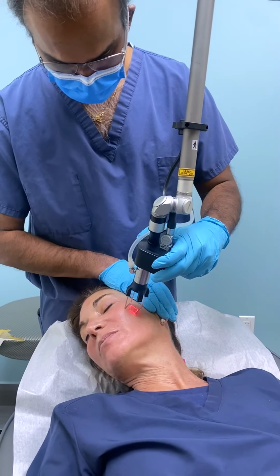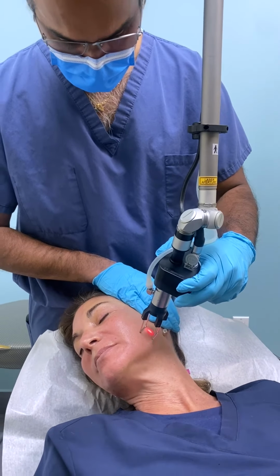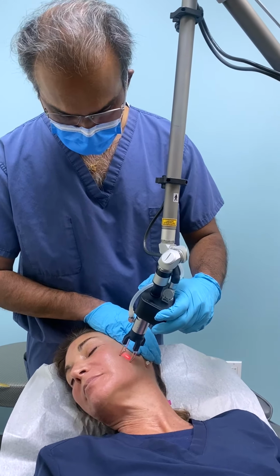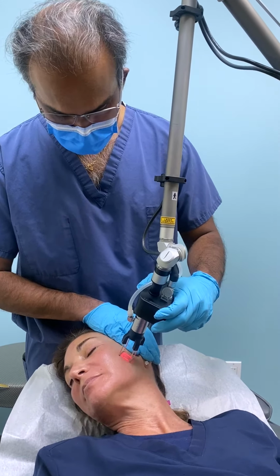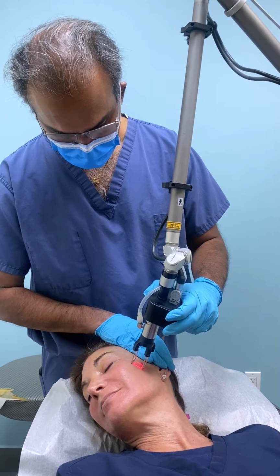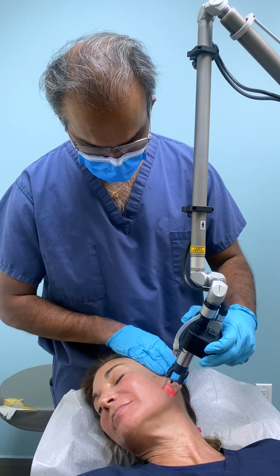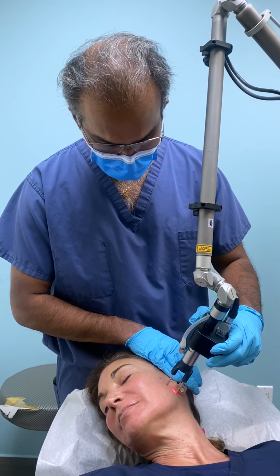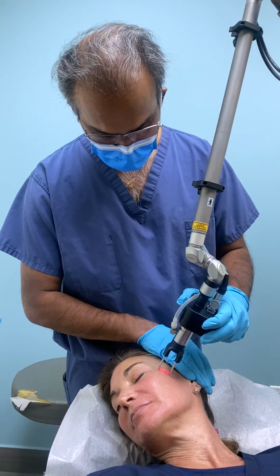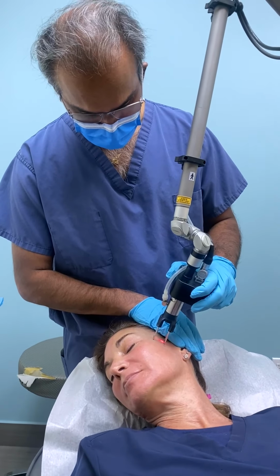And with the laser, then, what do I expect to see? Like the tightened skin, right? The fine lines. So, this specific laser, I think it's good for patients to really understand. This particular laser, which is a CO2 laser, is what I'm using, carbon dioxide laser. You can think of it as a pressure washer on the driveways, because it essentially peels off the surface dirt on the driveway, right? With the force. The laser does something somewhat similar. So it doesn't penetrate deep into the skin. It basically peels off the surface layer of the skin, and then if you want to do more, you go do it again and go a little deeper to see how deep you want to go.